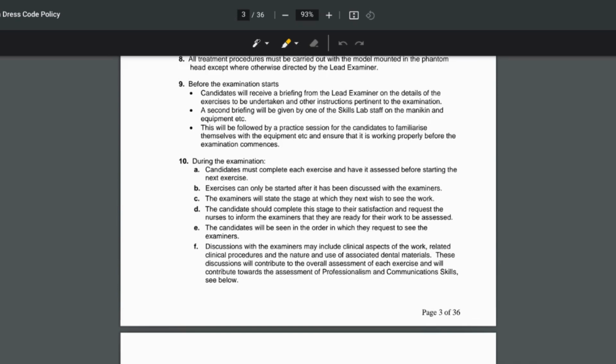The examiners there are there to help you. Honestly, they are not going to make things difficult, but they are there to listen to your problems, and they will be giving you a fixed set of things. You'll be informed about all the equipment. You will be given detailed instructions, and before starting the exam, a tooth will be marked with an X.